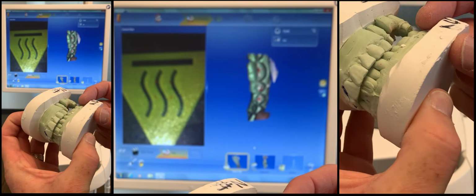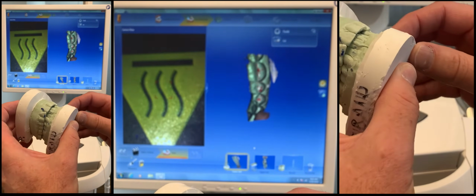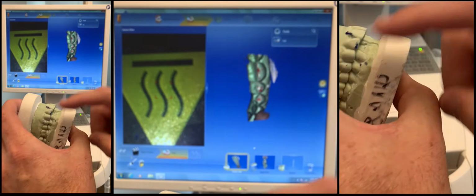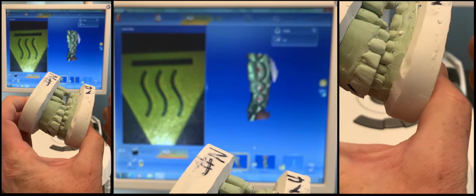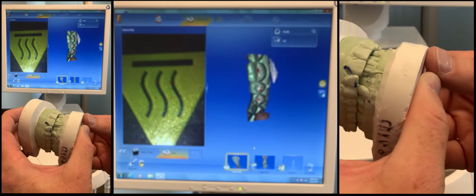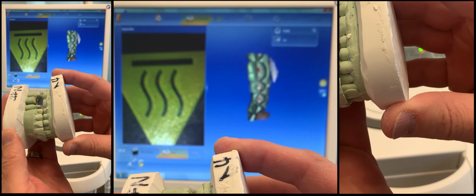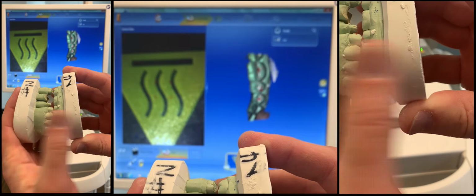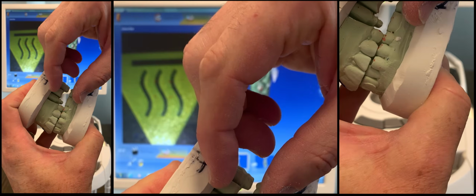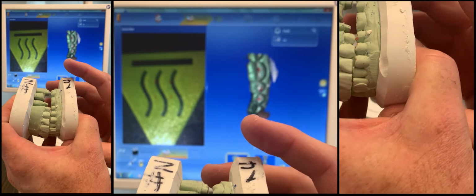If the patient's already numbed, it's not uncommon for them to bite incorrectly. So make sure that when you have them bite down, they're biting in their normal bite position, and that both sides are touching as much as they can be, given that we've reduced these out of occlusion, and that the teeth look like they're interdigitated correctly. Otherwise, if they bite wonky because they're numb and they can't tell, and you design a crown based on an incorrect bite, well, then you'll spend either 5 hours adjusting the crown to fit in the bite, or they'll come back and need a root canal or have a giant toothache.